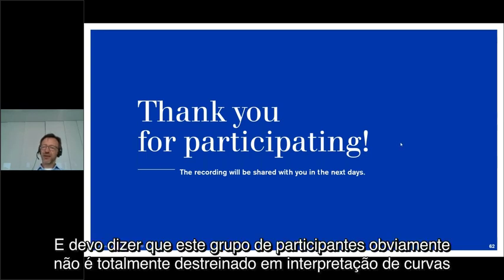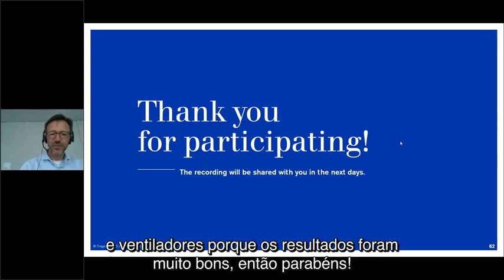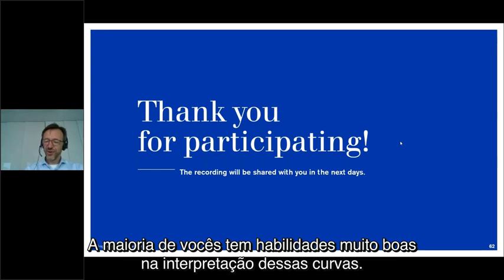I have to say, this group of participants obviously are not totally untrained in interpretation of flow and volume and of curves in ventilators, because the results were quite good. So congratulations.